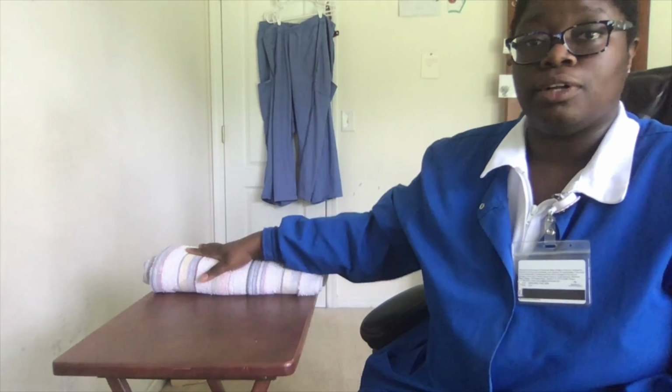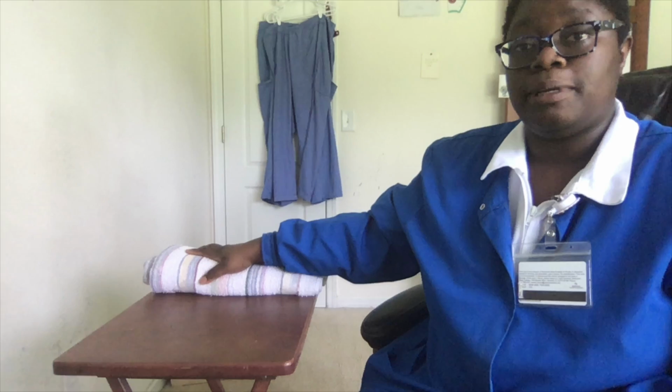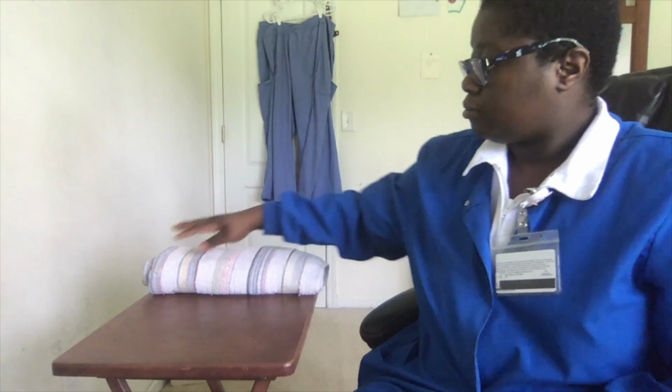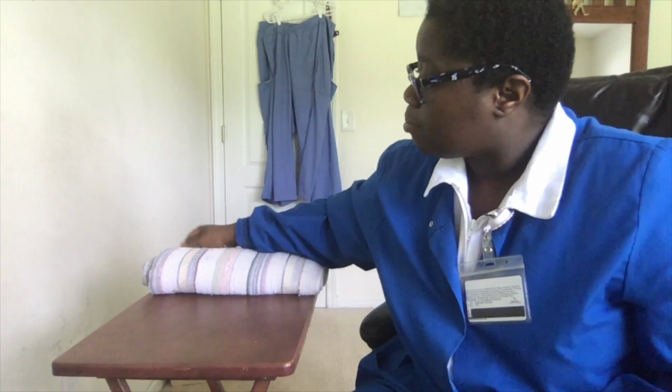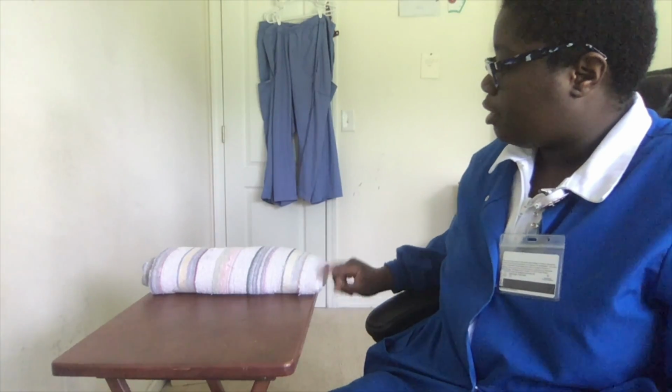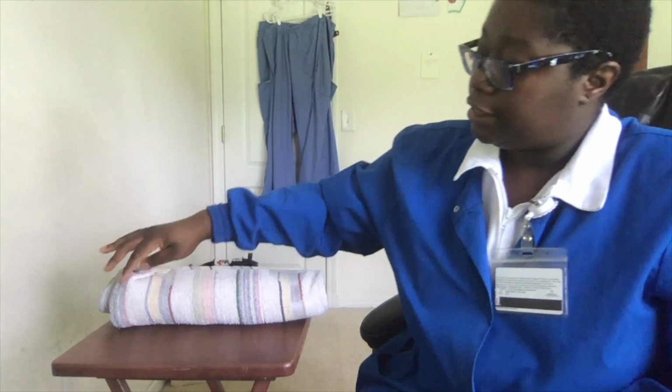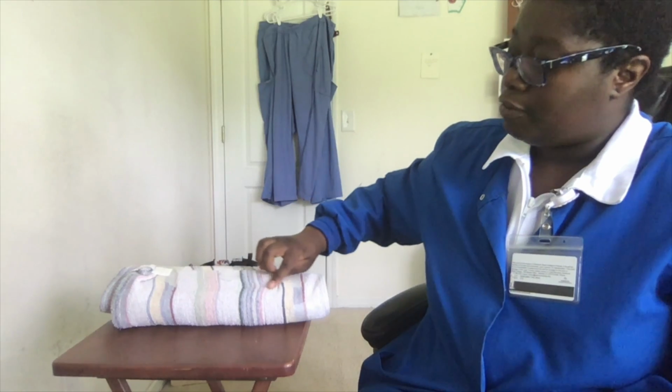The first thing I'm going to do is show you the three most common areas to give a subcutaneous injection as shown on this towel. The first being the anterior aspects of the thighs. The second being the abdominal region from the costal margins to the iliac crest. Last would be the outer posterior aspect of the upper arm.